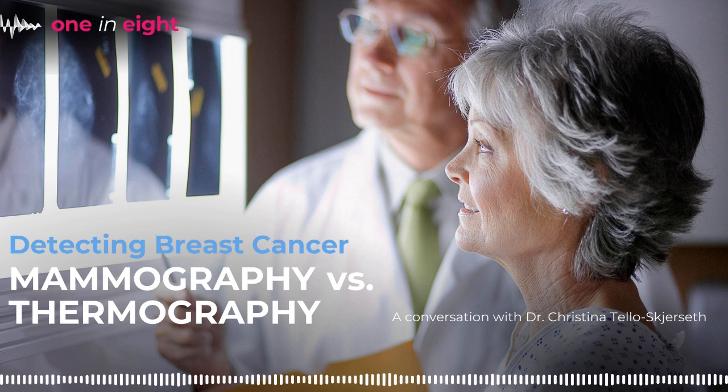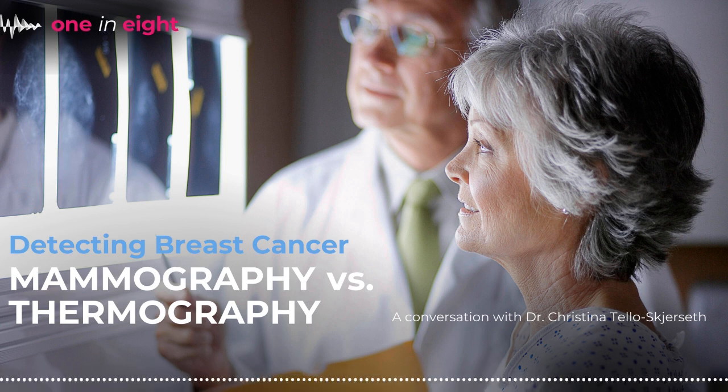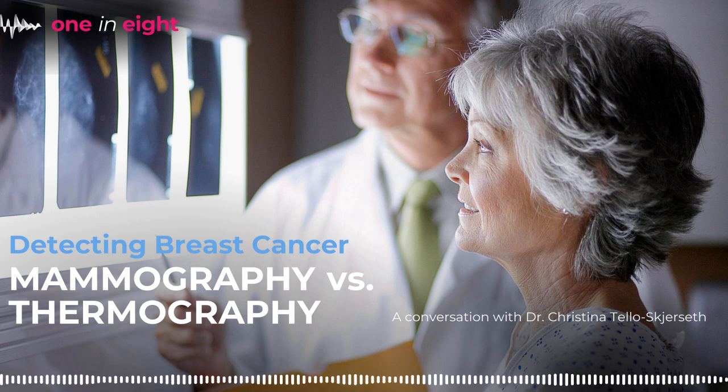And again, please know that mammograms are completely safe and very federally regulated so that things are being done safely and effectively. And it's the only modality we have that can decrease your chances of dying from breast cancer. And that's from decades and decades of research.